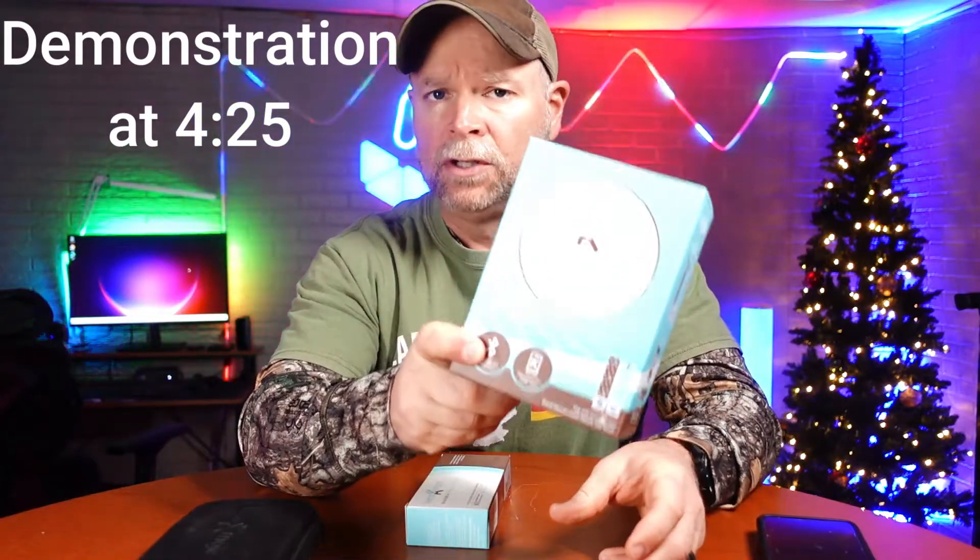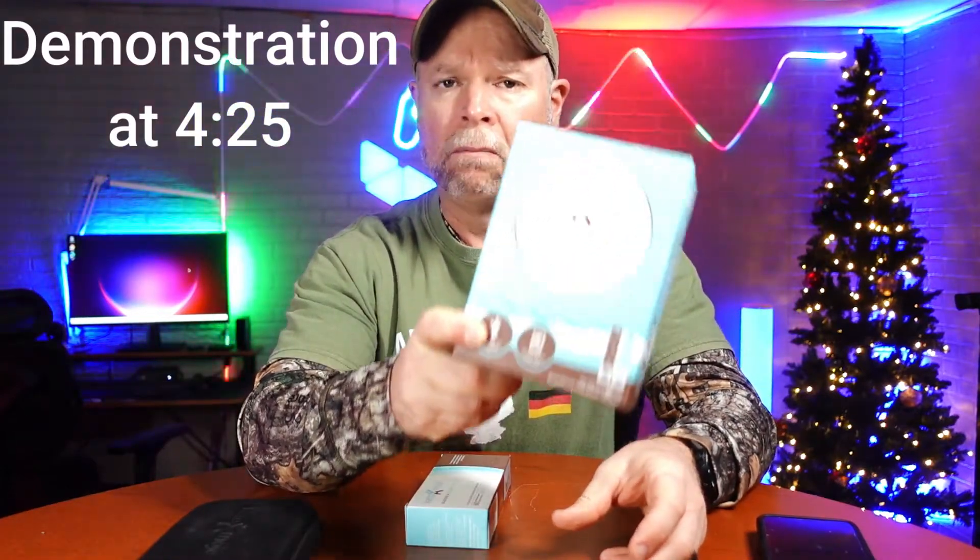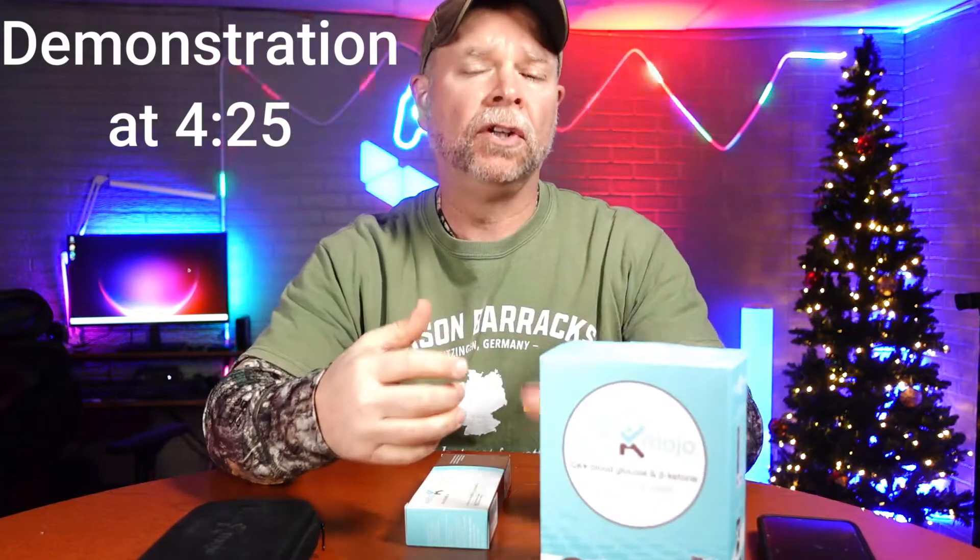Today we're going to be taking a look at the Keto-Mojo blood glucose monitor. It's going to monitor your blood sugar and your glucose, and it's also going to monitor your ketones. When you download the app that goes with this, it's going to give you your GKI, which is your glucose ketone index. It's going to let you know what level of ketosis you are in, if you're even in ketosis.